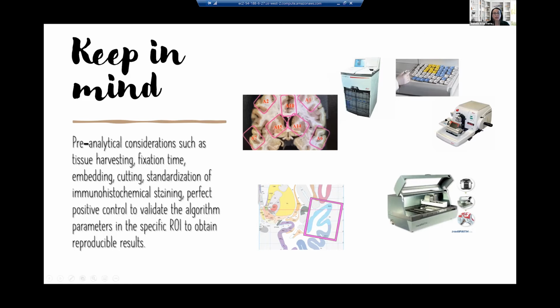Those pre-analytical considerations such as tissue harvesting, fixation time, embedding, cutting, standardizing the chemical staining, the type of auto staining that you use, or if you use a manual staining, those things can affect your image analysis.